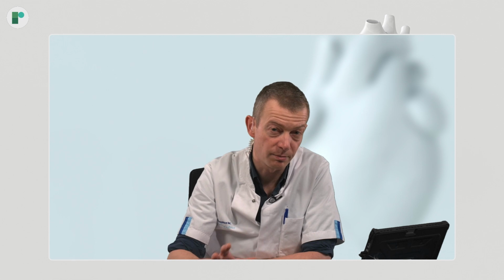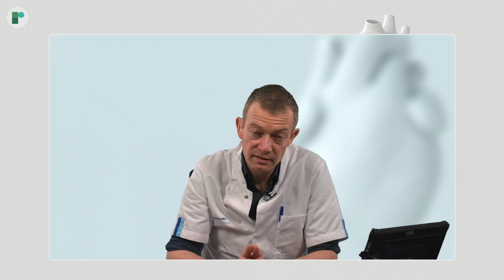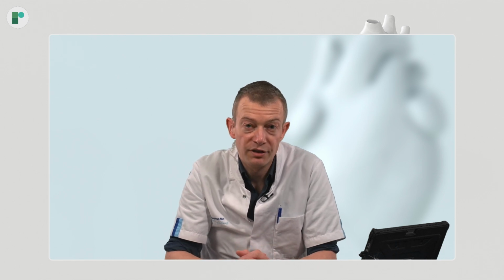So that brings me to the end of this webinar. I hope I was able to provide you some helpful tips and tricks to use IVUS in bifurcation stenting, to use IVUS to assess calcifications, to use IVUS in a standardized way in a pre, peri, and post-PCI setting, and some tips and tricks to assess the bifurcation anatomy and the wiring in a patient that underwent an intentional approach with provisional bifurcation stenting.